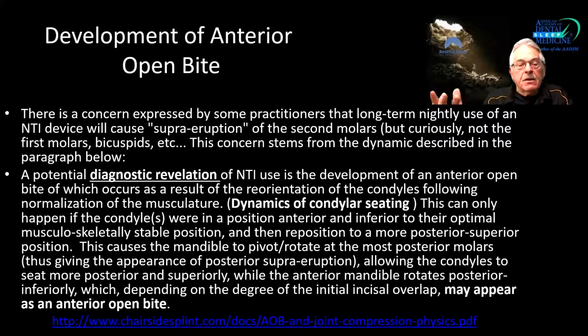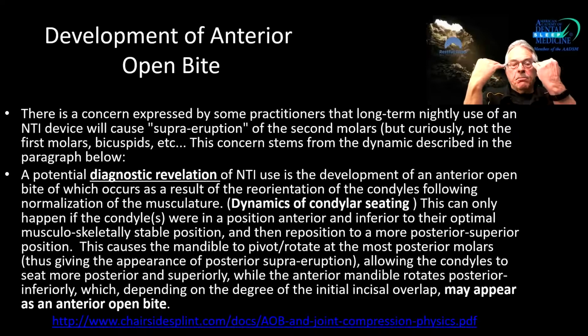In other words, they're not in the center of the fossa. Let's just call it the normal position. And then they reposition to a more posterior, superior position upon wearing the NTI appliance. This causes the mandible to pivot or rotate as the condyles move to the most posterior, superior position, and the mandible rotates like this and you get an anterior open bite.